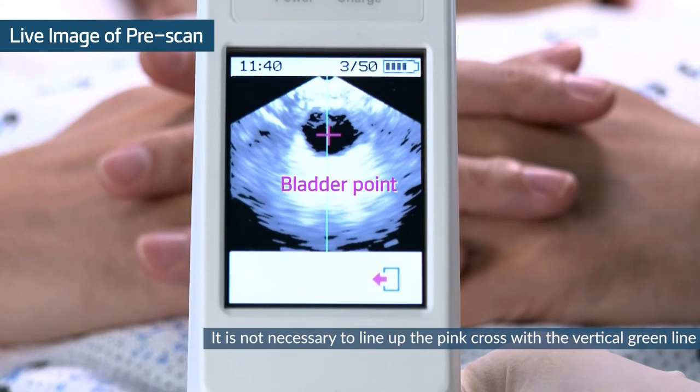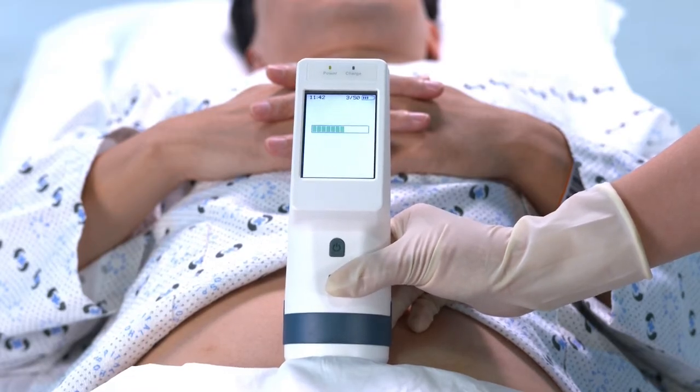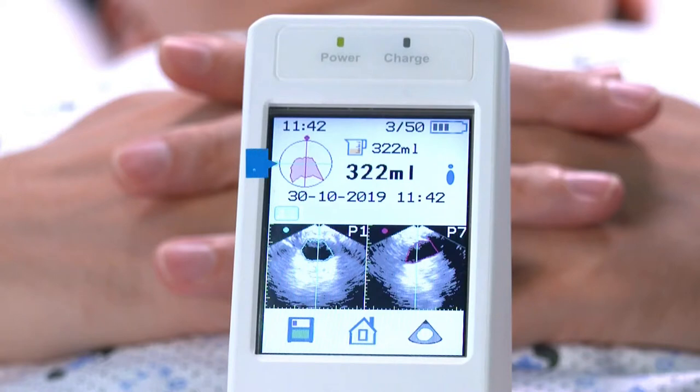Press the scan button again. Hold the probe steady until the scan is completed. After the scan, the measurement can be evaluated by the aiming information. The closer the bladder image is to the center, the better the result.